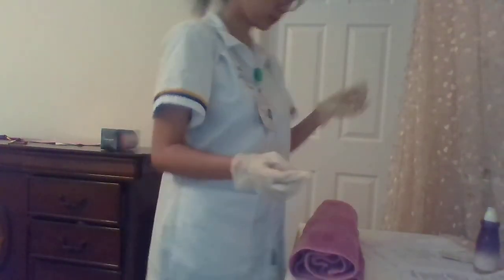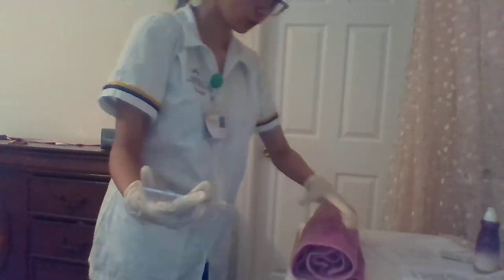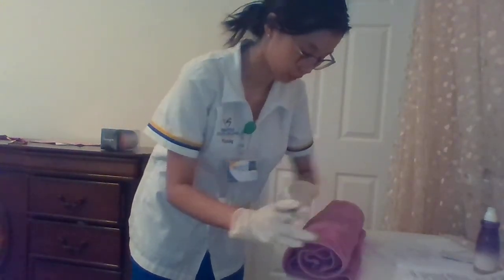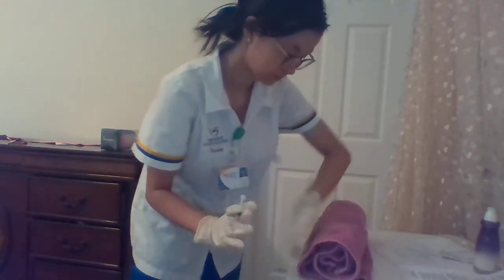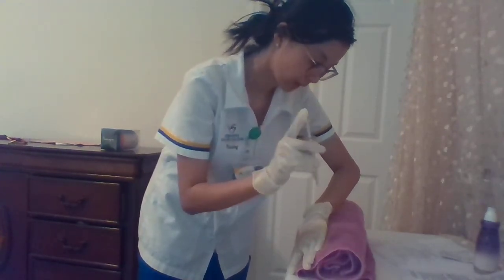And after I clean the site, I am going to use the Z-track technique, which is pulling the skin to one side. And then I insert my needle at 90 degrees.